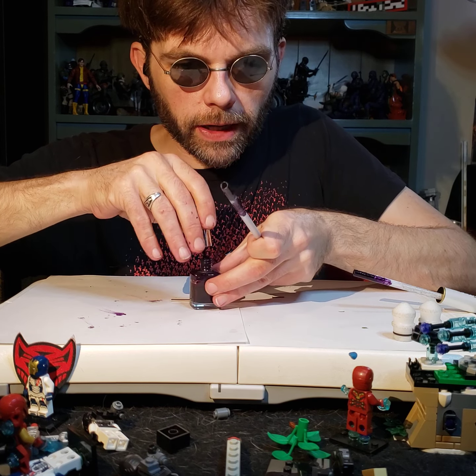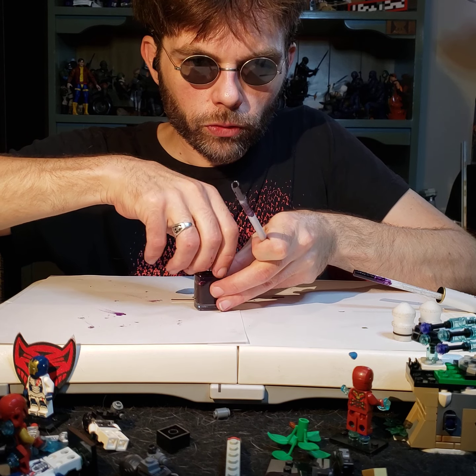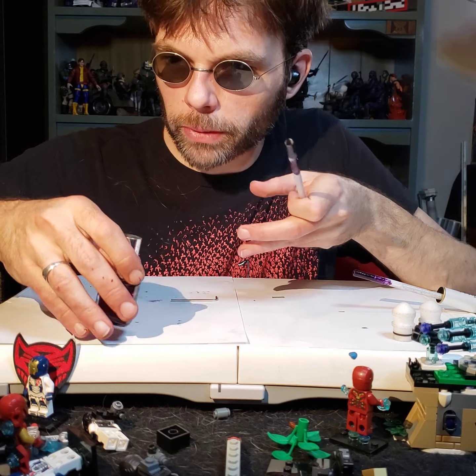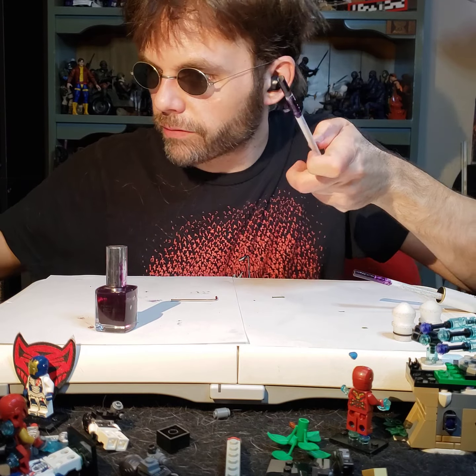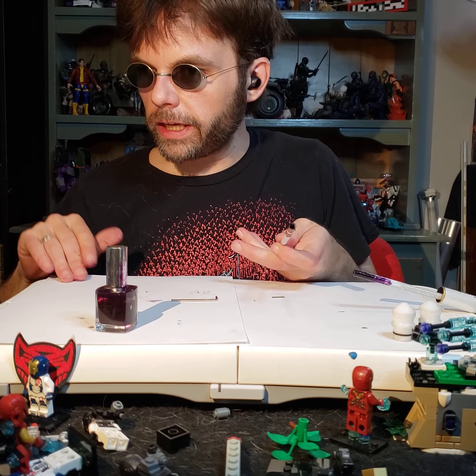Okay, I think that's enough. I think I got it enough. Let's put that back in there. Screw you shut. There you go, sir. Are you tight? Good. Mix it up just to make sure. Set that off to the side because I think we're done with our nail polish. Fingertip got a little sticky.